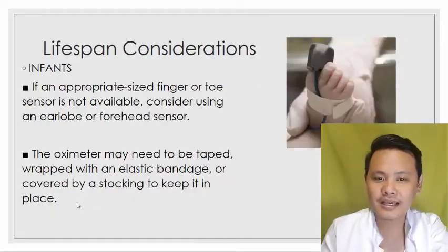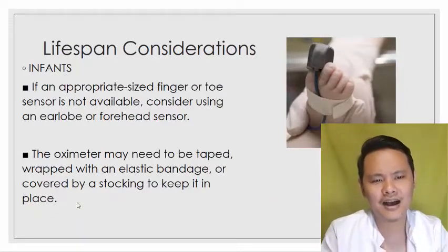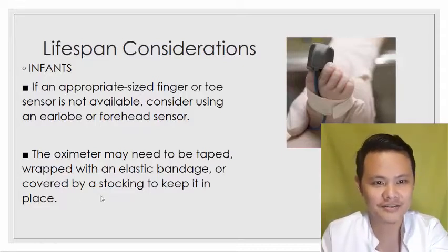Okay, next, how about the lifespan consideration? Ano ba yung mga dapat natin i-consider in using the pulse oximeter? As you can see in the picture, there is a neonatal.